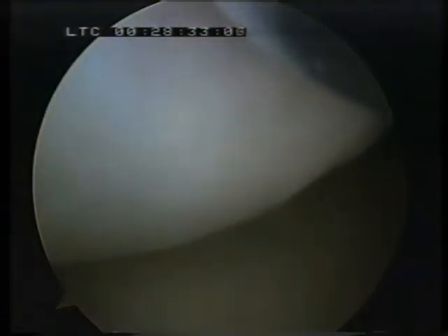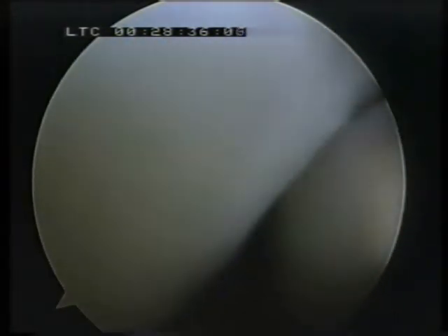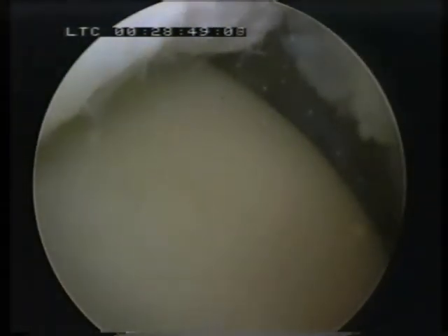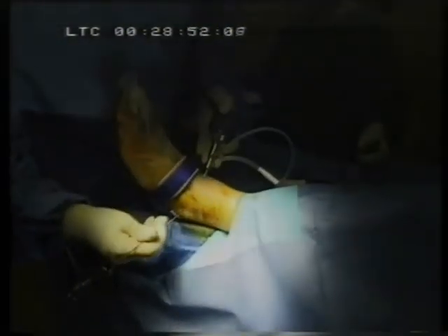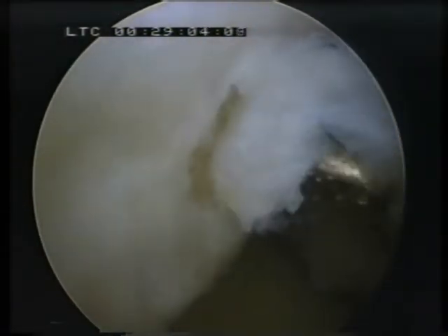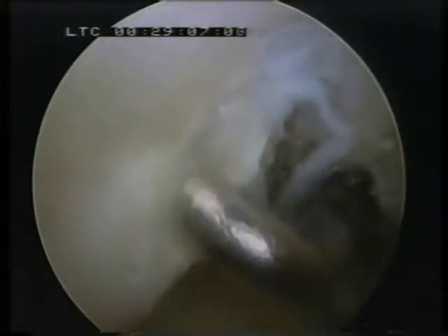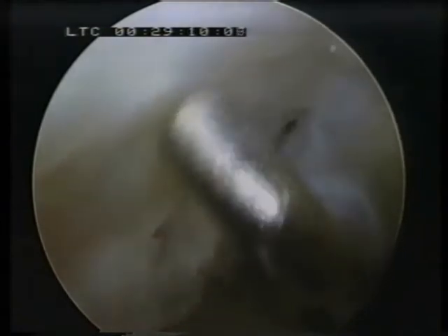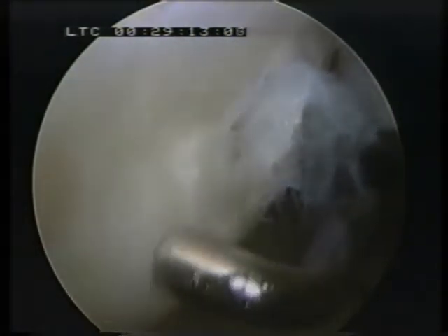The synovitis is quite easily removed using this instrument at the front of the joint. This is particularly important when you have bony ankle impingement — you need to perform this removal of the synovitic material very thoroughly. I'll show you what the spur looks like in these chronic ankle sprain type syndromes. This gentleman doesn't have particularly pronounced spur development at the front of his ankle joint, but this region needs to be addressed by performing a rigorous capsulotomy so you can see all of this area at the anterior aspect of the ankle before you start to remove the spur when it is present.